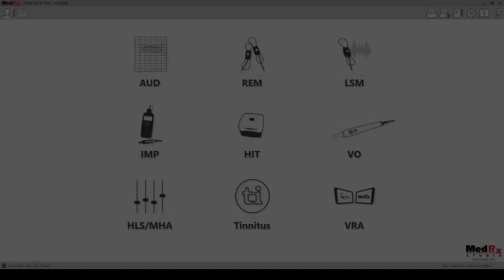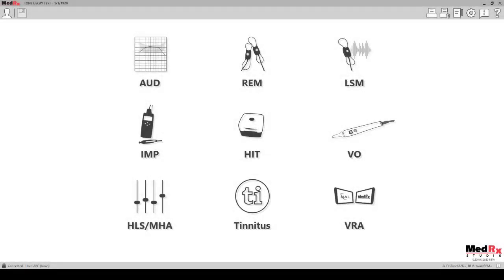And now we will review how to complete the tone decay test within the Medrex Studio software.